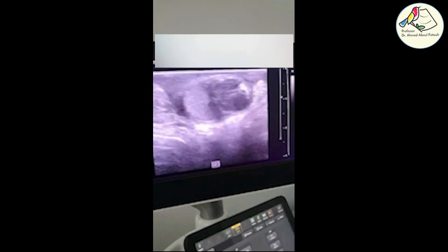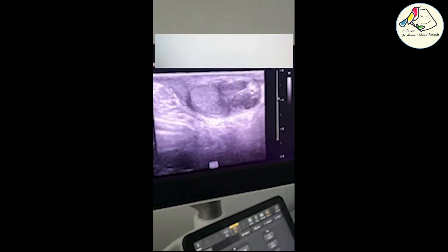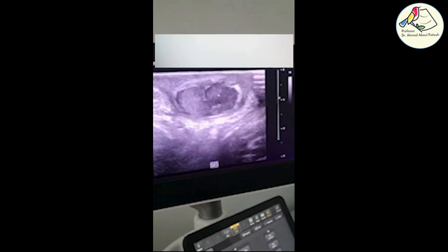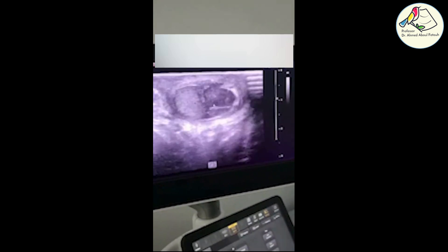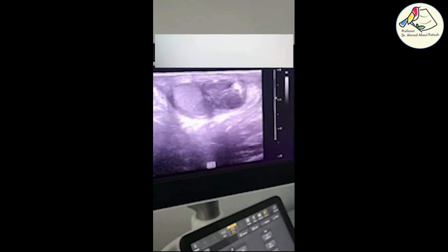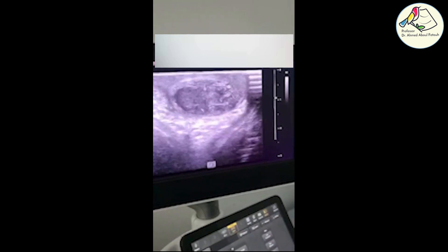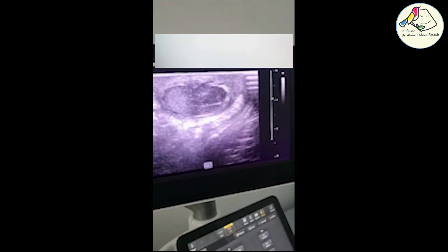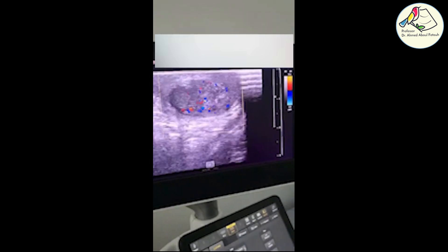I consider all of these structures on the lateral side to be outside the testicle. Given the history of trauma, we are dealing with a hematoma at the region of the rete testis — more consistent with an extra-testicular hematoma rather than an intra-testicular one. We will confirm and reach a final diagnosis.